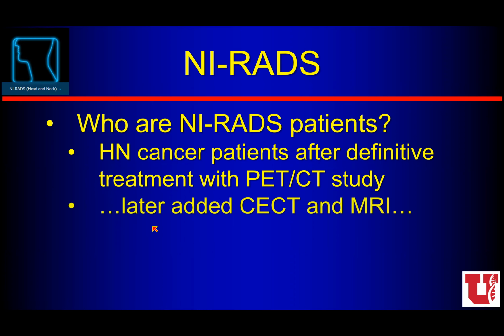Now, later they did add contrasted CT and MRI to that staging system. But the idea is with NI-RADS patients, it's only head and neck cancer patients, and initially it was just squamous, and it was only after definitive therapy and only if they had a PET-CT study. Now, there aren't that many PET-CT scanners around, so that's obviously going to limit the number of patients who do this.